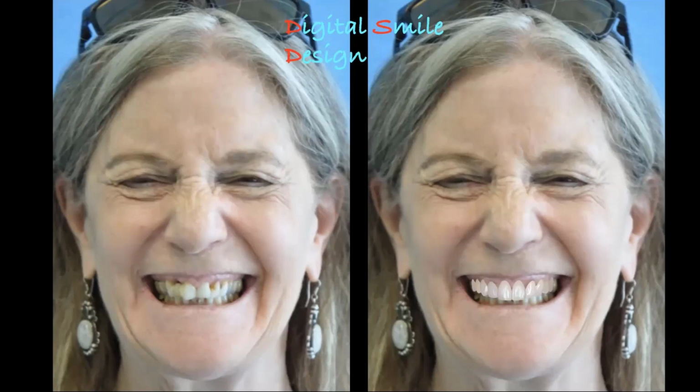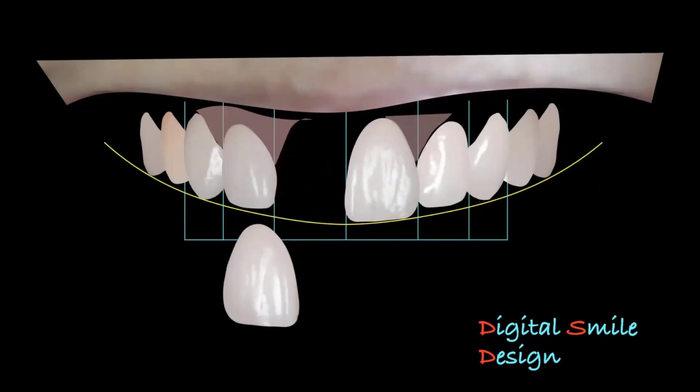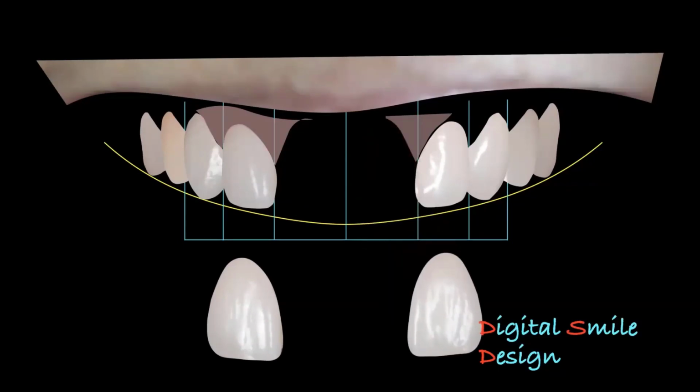What do you think? And if they don't like it, then we're able to take each tooth out, shape it, adjust it, put it back, whatever we've got to do just to be able to put it back. So in the end, you're using technology to really, really communicate. CBCT technology is part of this workflow.